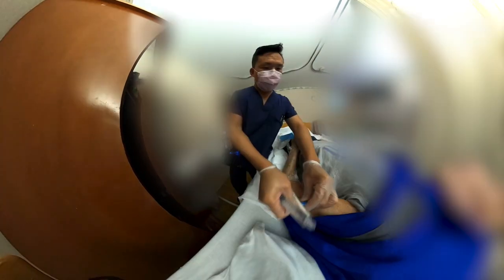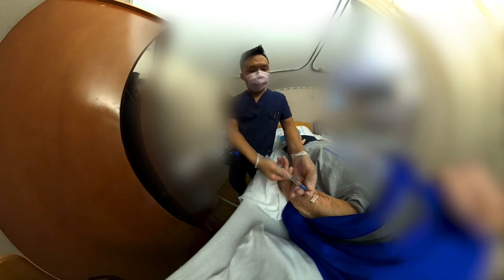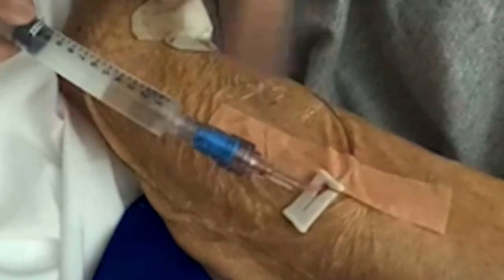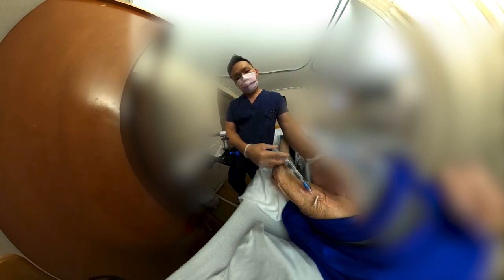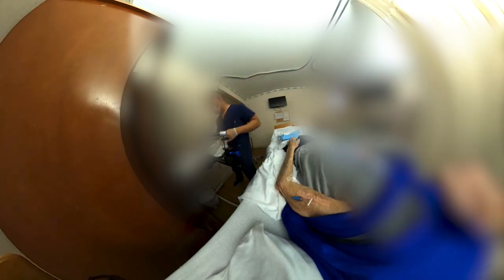Thank you so much. And because it's such a weird placement, after I finish dressing it, I'm gonna do one more check. Like that. Good, no resistance, no sound of infiltration.